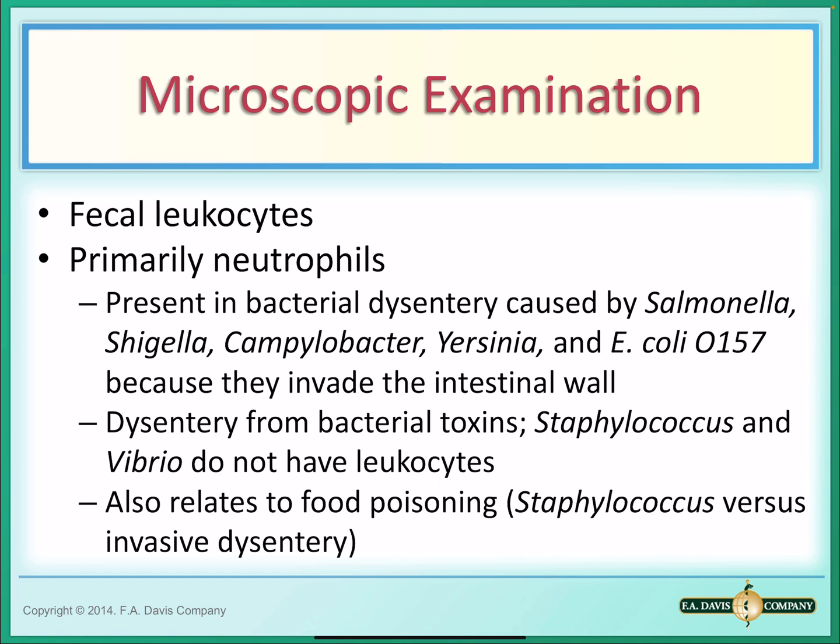We are also looking for leukocytes to find out if the patient has some sort of virus or parasites. But typically, we're more concerned with the formation of leukocytes due to bacterial pathogens, not so much with the viruses and parasites. So the presence or absence of fecal neutrophils can provide the physician or the caring nurse or physician assistant with diagnostic information before receiving a culture report from the fecal matter.